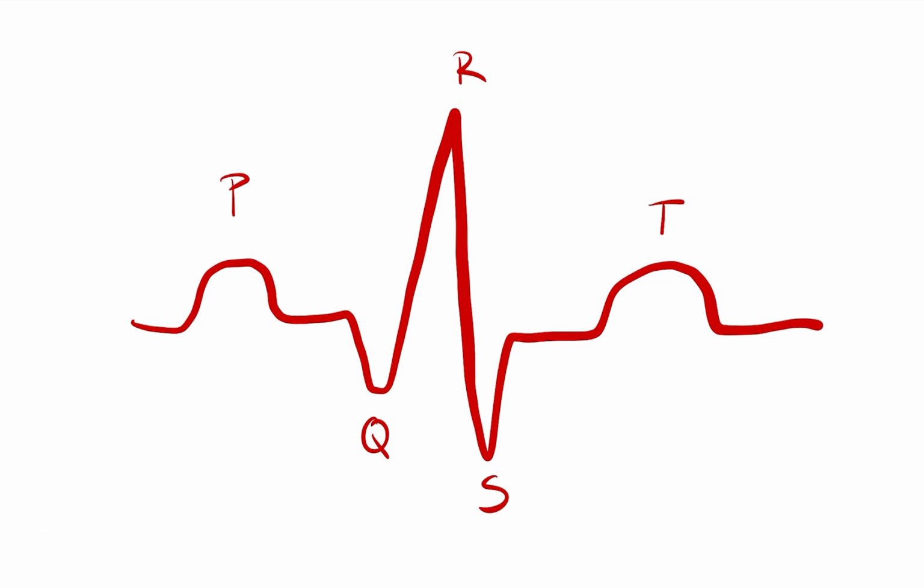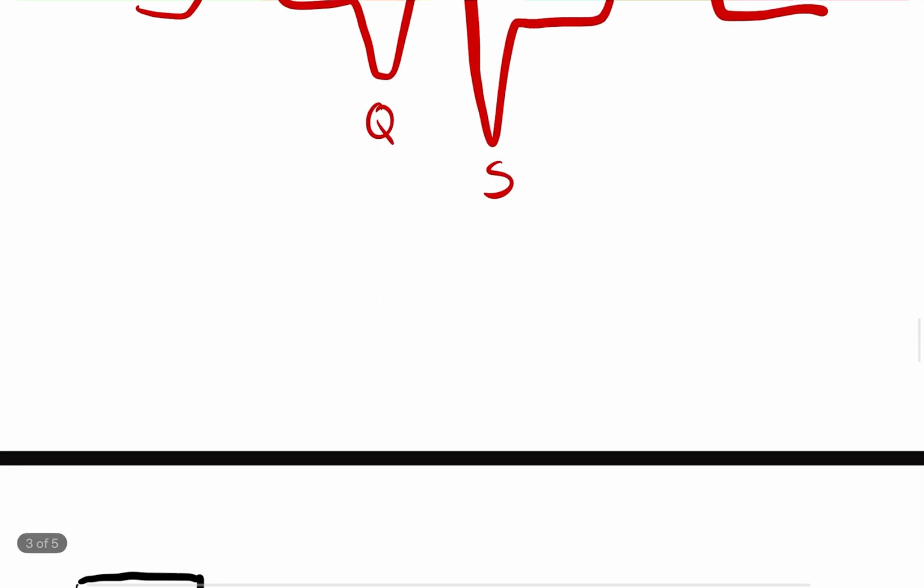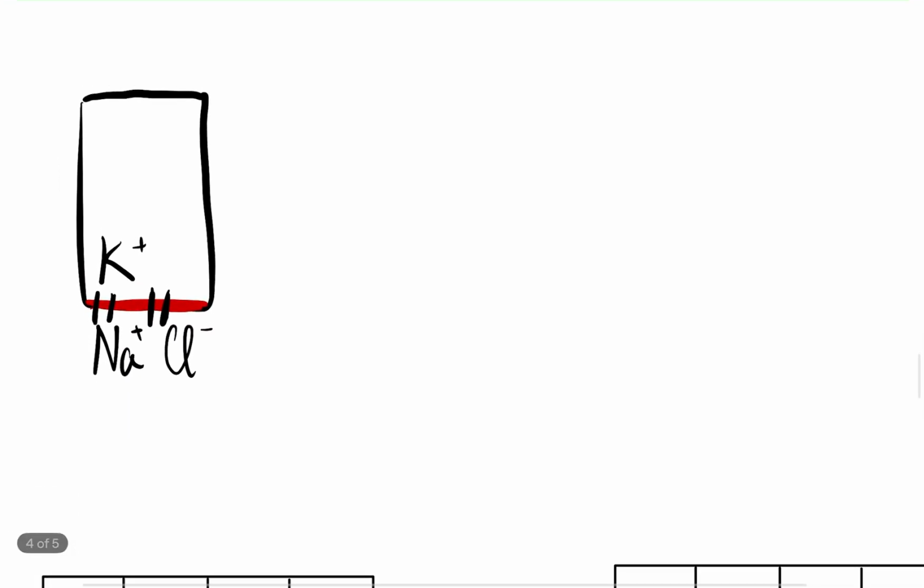Right, so this is the typical ECG wave, or waves, how we see it on people's tattoos and t-shirts and whatever. But this is how it looks, and today we are going to explain why it looks this way, why this is the physiological rhythm, and how the ECG should look graphically.